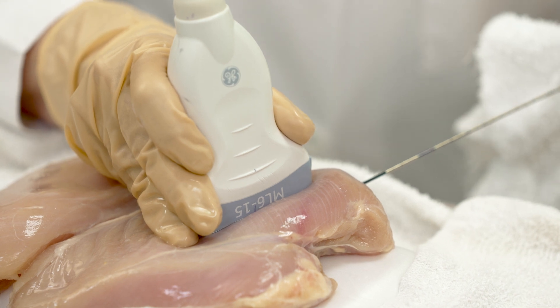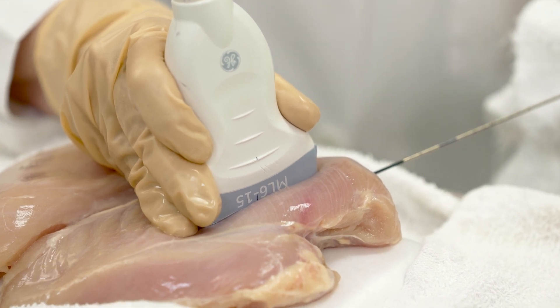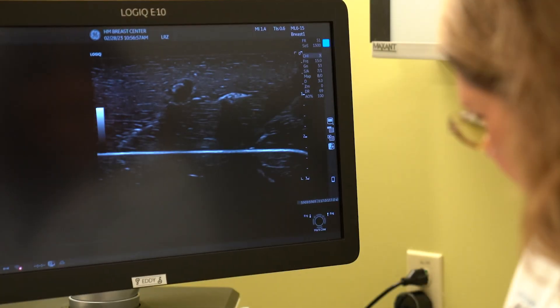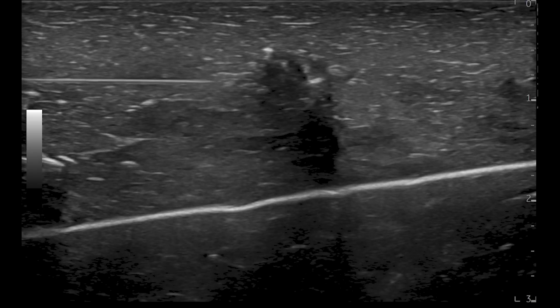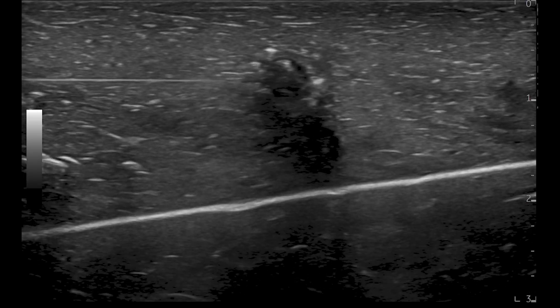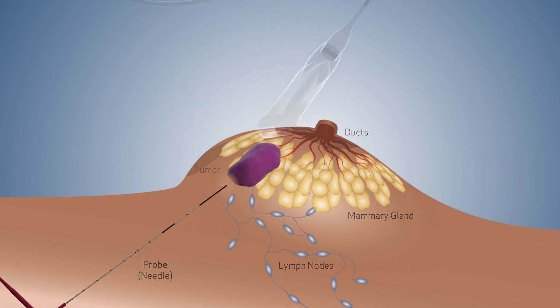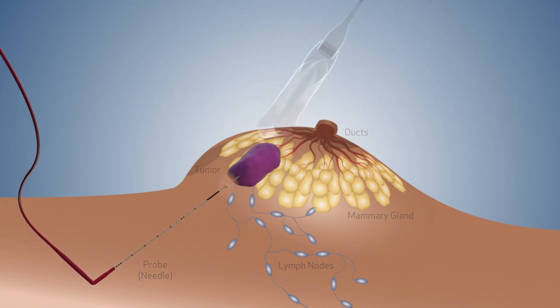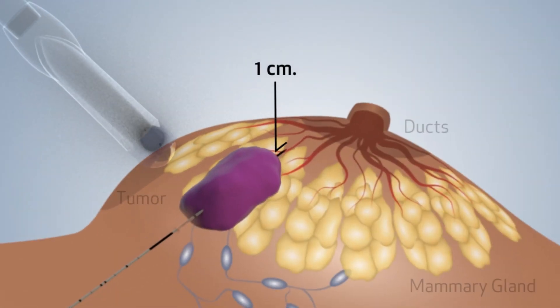To begin, the first step is to insert the probe, which serves as the needle for cryoablation, into the designated area. On the screen, you can observe a white line moving towards the target, indicating the progress of the probe. Once the probe reaches the target, it is inserted slightly beyond the target, aiming for a penetration of approximately one centimeter in all dimensions. This positioning ensures optimal coverage.